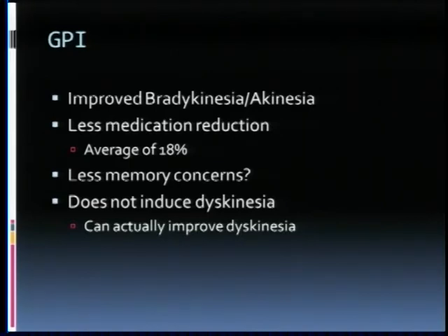So if I have a patient who's coming to me and they're taking quite a bit of medicine, or they're having difficult or intolerable side effects from their medication, one of the things I'm keeping in mind with implant is, well, which target will allow me to reduce medicine more, knowing that down the road, even though I've reduced it after surgery, 5, 7, 10 years down the road, I may have to increase it again somewhat to help with the progression of their Parkinson's disease. So that's something we keep in mind, and probably why STN wins out for a lot of people is that medication reduction component.